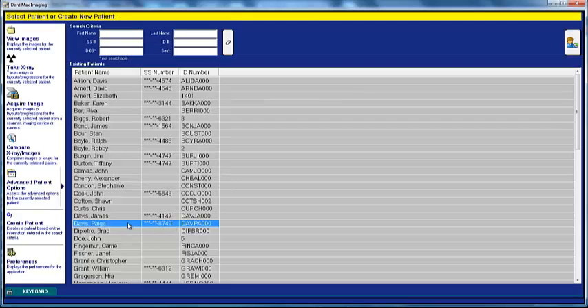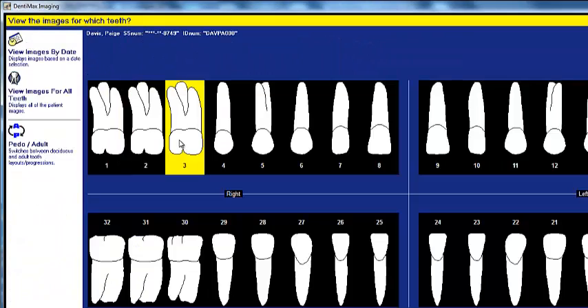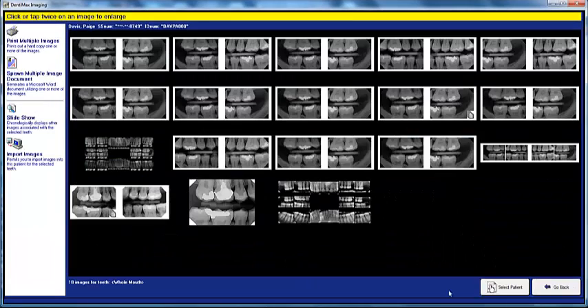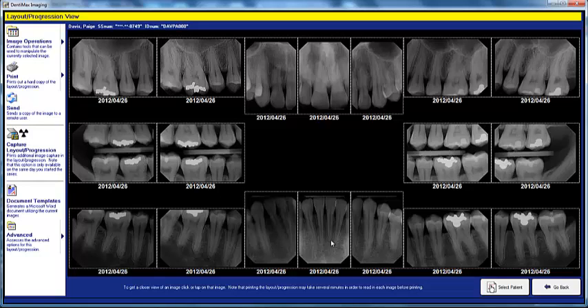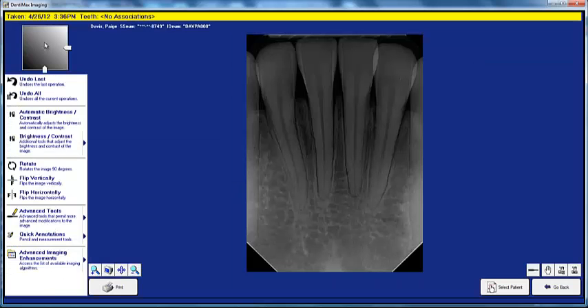Let's go ahead and take a look at the x-rays for Paige Davis. To look at x-rays, all you have to do is click on the View Image button. You can click on a tooth to see all the x-rays associated with that tooth, view all images, or view images by date. I'm going to take a look at this full-mouth x-ray series. To really zoom in on an x-ray, just double-click on it. From here, you have all sorts of wonderful tools. Most doctors use a few select tools since you have a patient sitting in a chair and want to be fast and efficient.